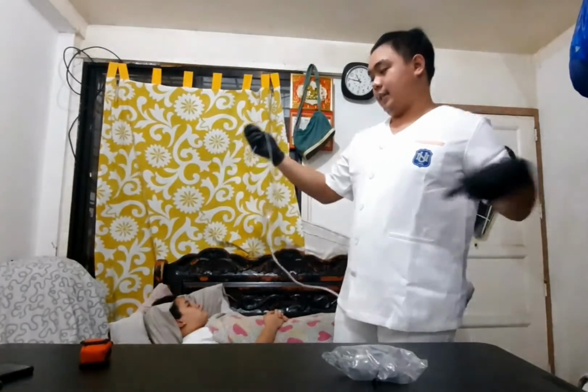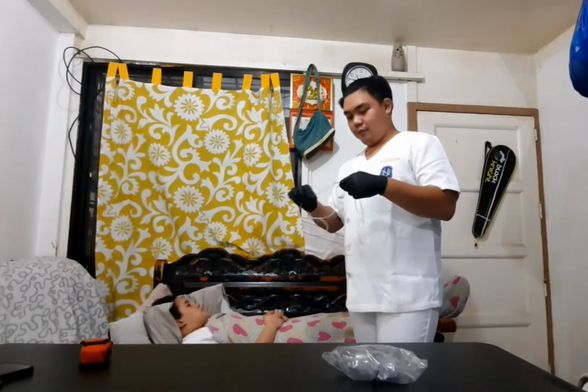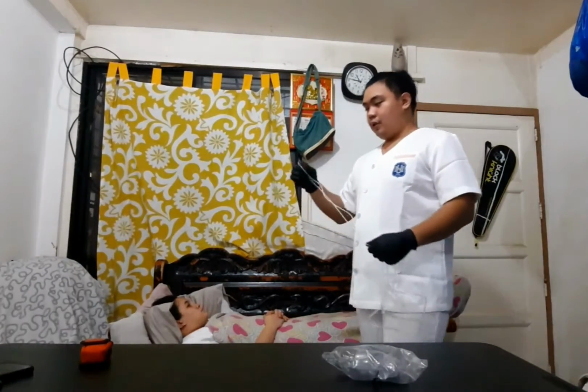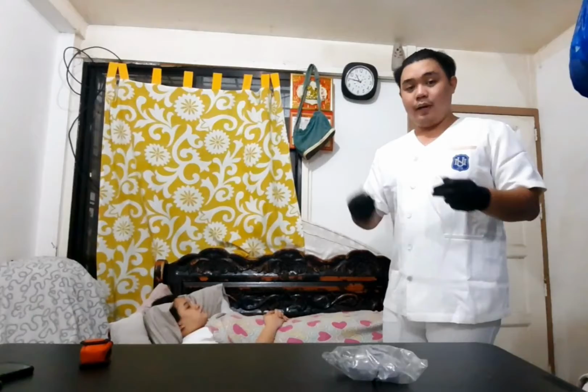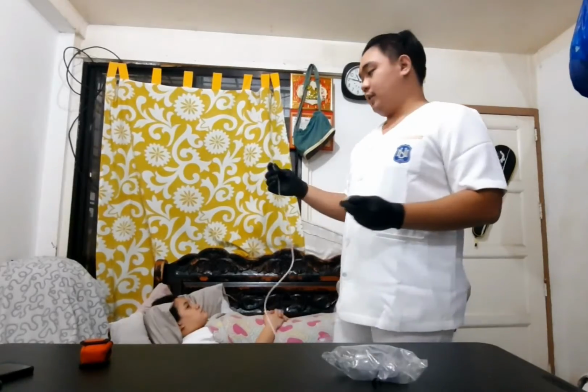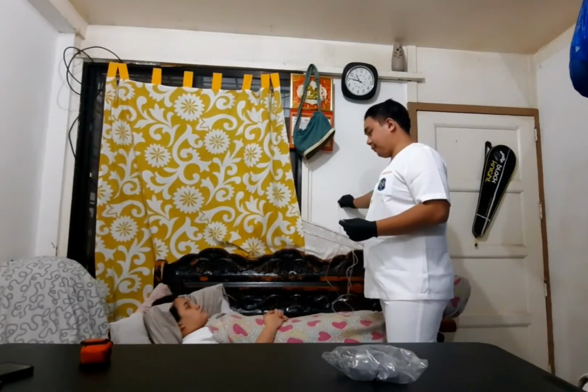So here is the nasal cannula, assuming that it is already connected to the flow meter or the gauge with the humidifier connected.